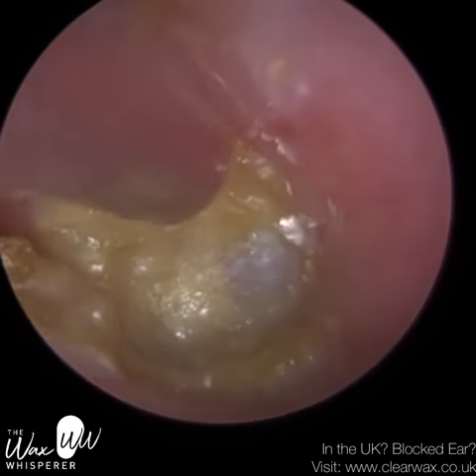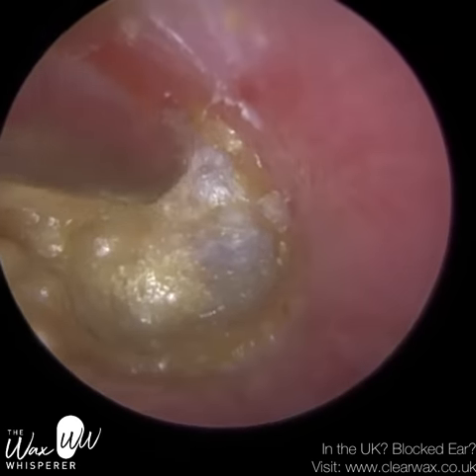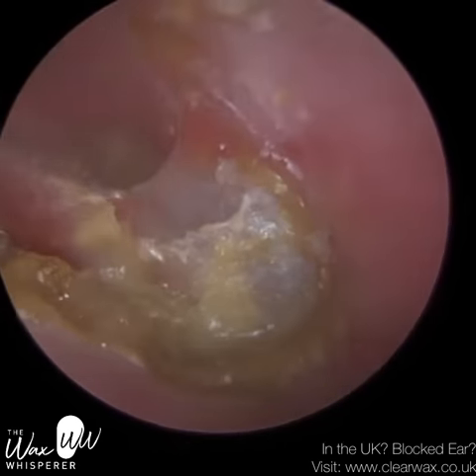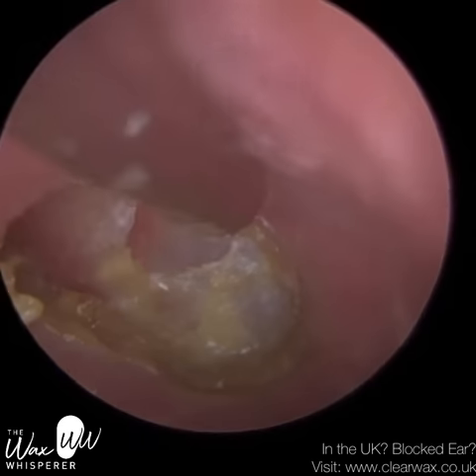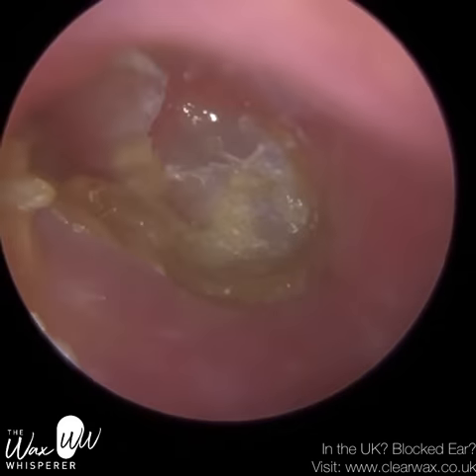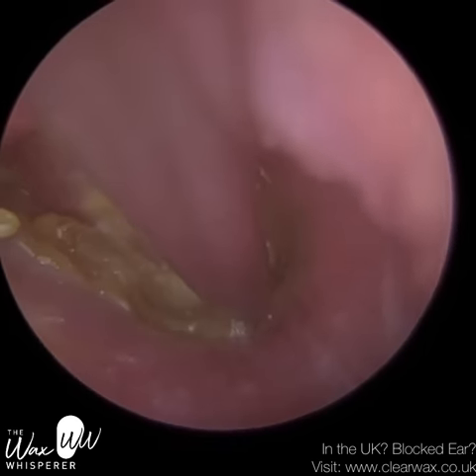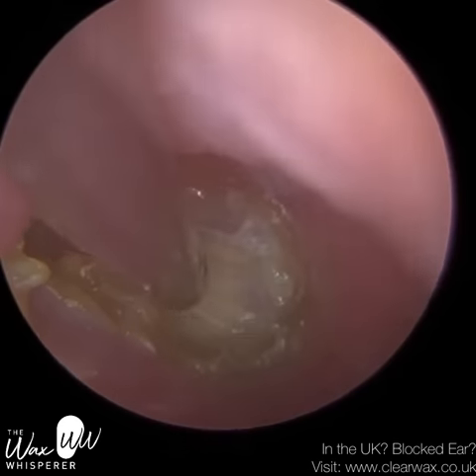So I'm using the fine end now. You can see some of the underlying eardrum there. Compared to when the patient first came in, I'm really, really happy even at this stage. You can see the difference — how clear the ear canal is. The patient is on a regular prescribed treatment, a topical treatment for their otitis externa. They use antibiotic steroid drops on a regular basis.